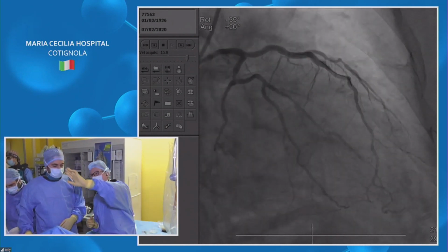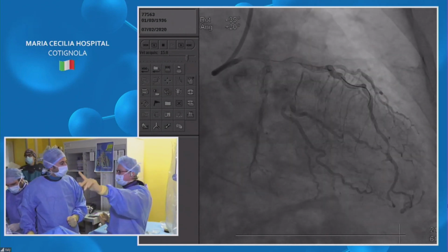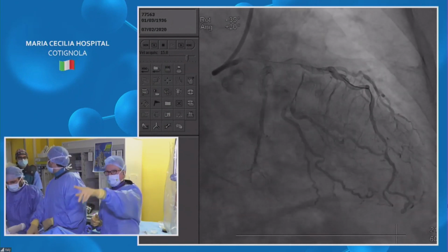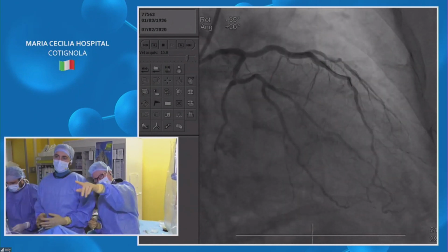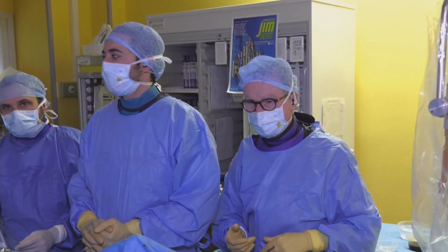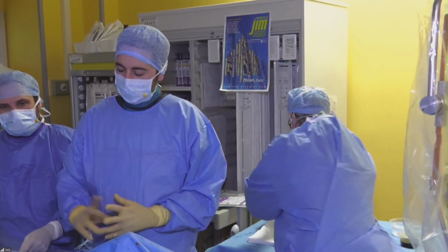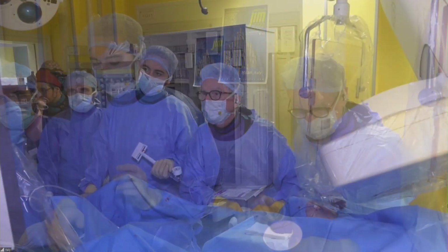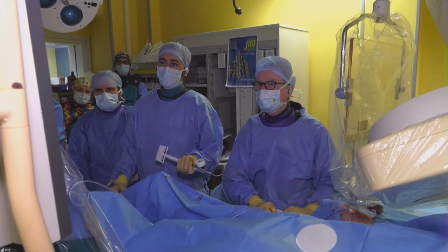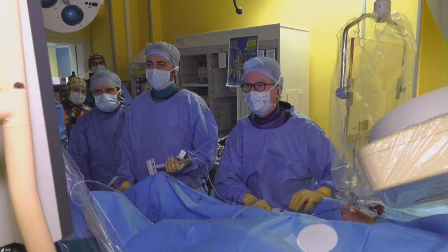Okay, I'm going to have you go to Dr. Giannini. I'm going to open a new FFR wire. Another FFR wire. Check distal and check proximal what we have done, and I promise I'll get back to you after Giannini. Okay. Perfect. Good work. Thank you. Antonio, you are back to your lab here. Can you hear us, Antonio?